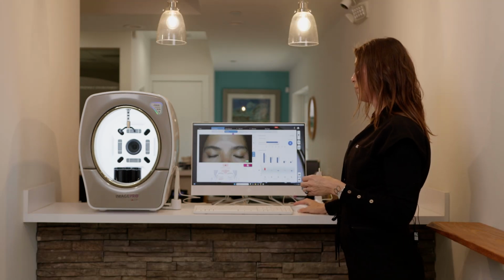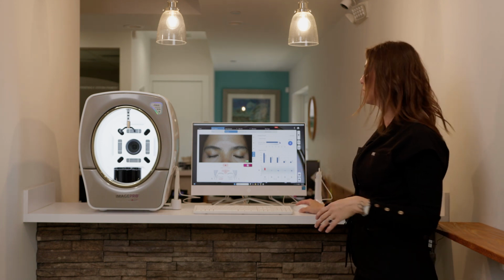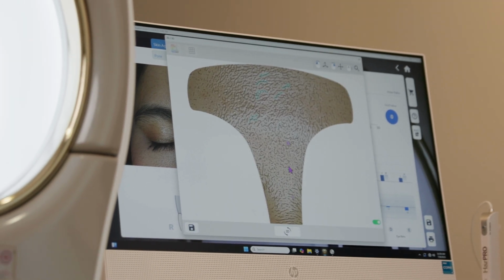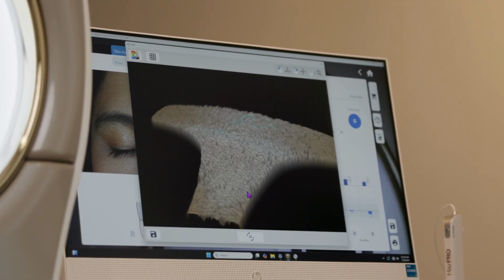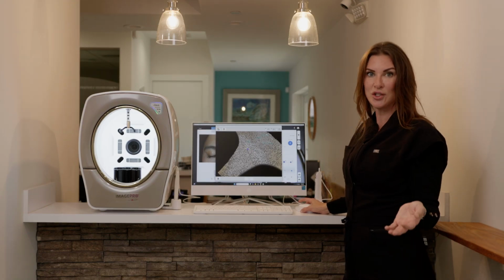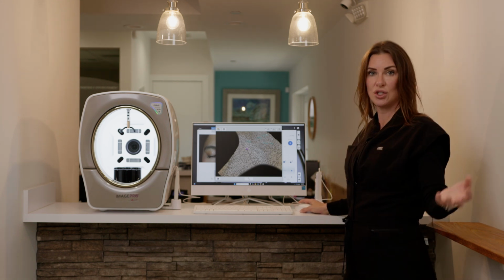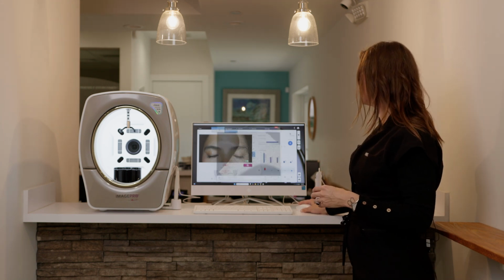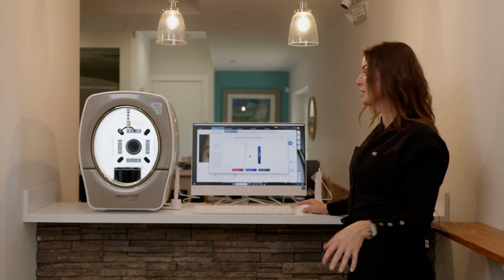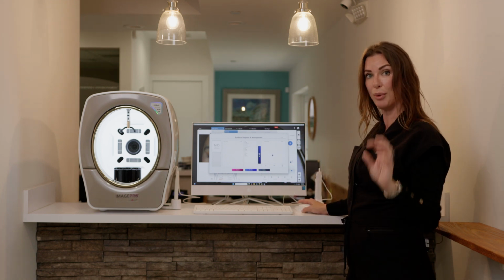Moving on, you have wrinkles. So she's right there with her average age group, not necessarily something that we need to address. But if there was, and I'll just pull this up. So when your pores start to align, it will actually highlight them in blue. And those are where your wrinkles are starting to form. So this is your opportunity to sell your neuromodulator, right? So we're going to use about 18 units, 25 units, whatever. You as a practitioner are going to recommend this. And then what you'll do is you'll go to that cart where you would have already logged in all of these different products and services, and you will move those over into her cart. It will save at the bottom as a part of their treatment plan.